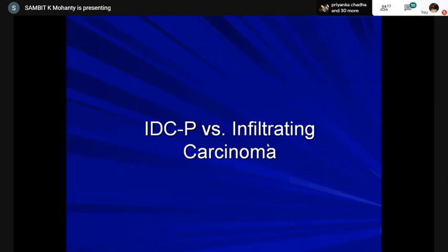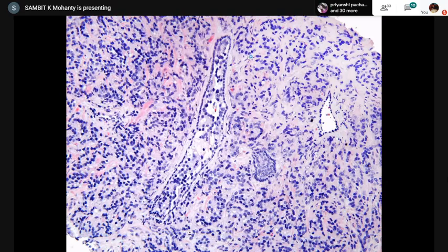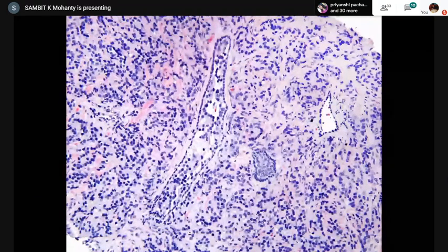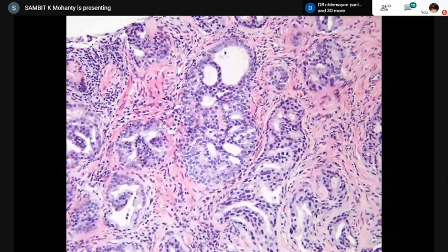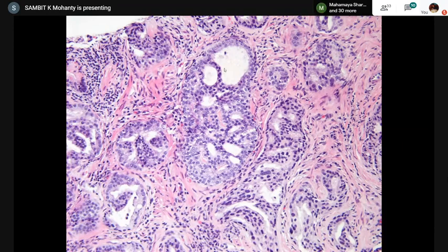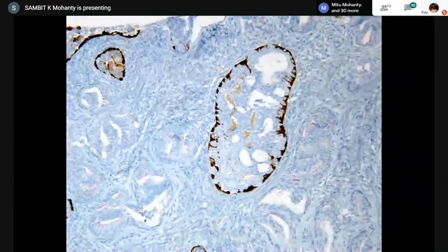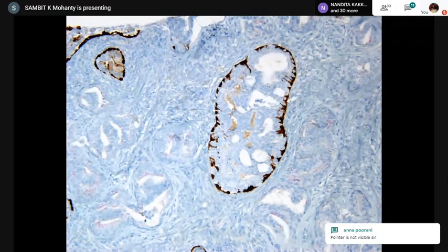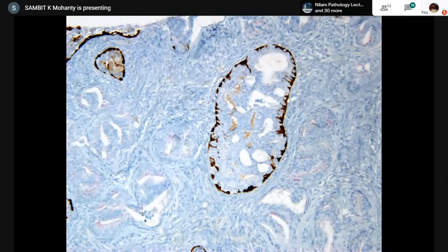IDCP versus infiltrating carcinoma: the benign duct versus pure tumor. A focus with thin spindle cells in the periphery and smooth contour is likely IDCP. When the contour merges with the periphery with some desmoplasia and angulation, it is infiltrating carcinoma. On PIN4 cocktail: the center gland with smooth contour is IDCP with retained basal cells (brown staining). The glands with angulated contours and loss of basal cells are Gleason pattern 4 adenocarcinoma. The key architectural feature differentiating IDCP from Gleason pattern 4 is the smooth, non-infiltrative contour. Do the basal cell stains when it could make a difference in the grade or when the volume is low; if the volume is high it may not be required.